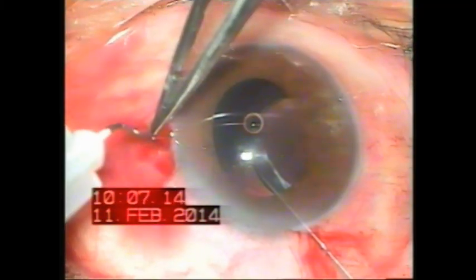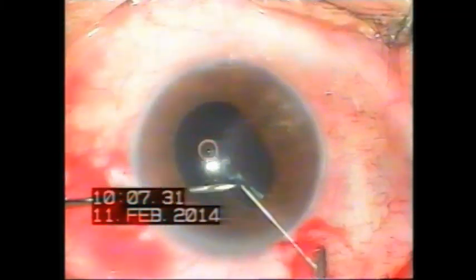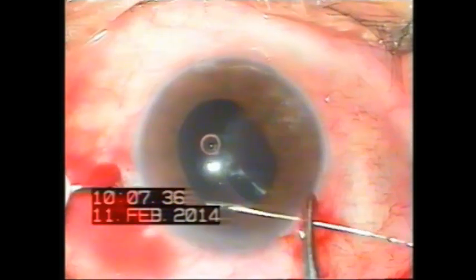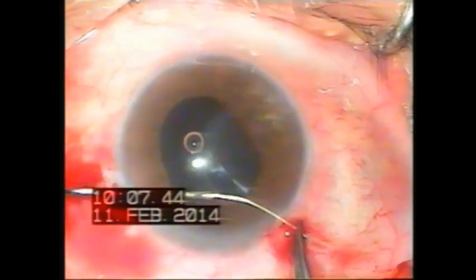Suture was given a second pass. 10-0 proline needle coming through paracentesis while 27 gauge syringe needle entered through fixation suture site. Thus suture passage was repeated in opposite direction but anterior to the IOL haptic this time.